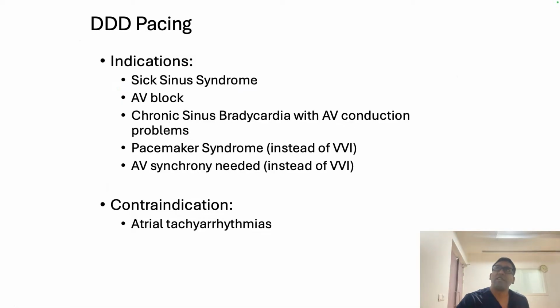So that's why, an indication is sick sinus syndrome when the patient is having AV conduction disorder. So these are the indications. I think we should not go for this.